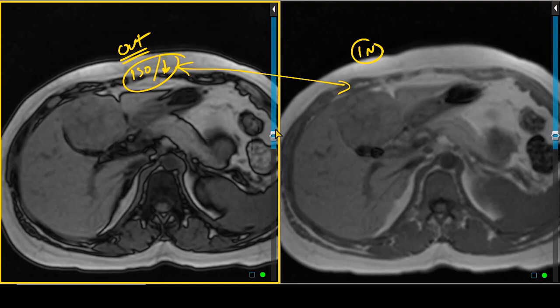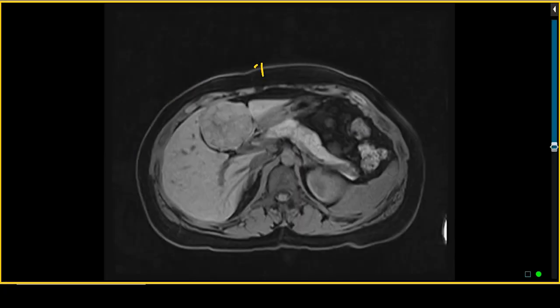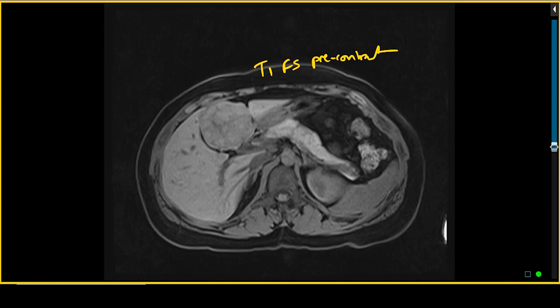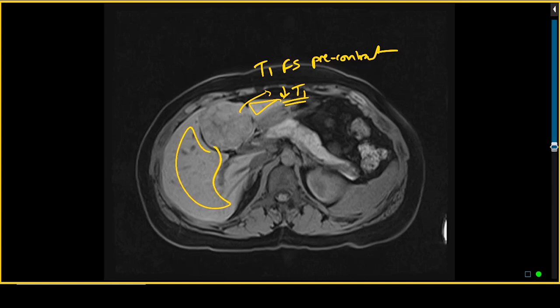At the periphery of this lesion, there is some increased susceptibility artifact, which comes from cholecystectomy clips in this patient who had prior gallbladder surgery. On the T1 FATSAT pre-contrast image, the lesion overall has signal intensity similar to the liver parenchyma, but looking critically, it is a little bit T1 hypo-intense with respect to normal liver parenchyma.